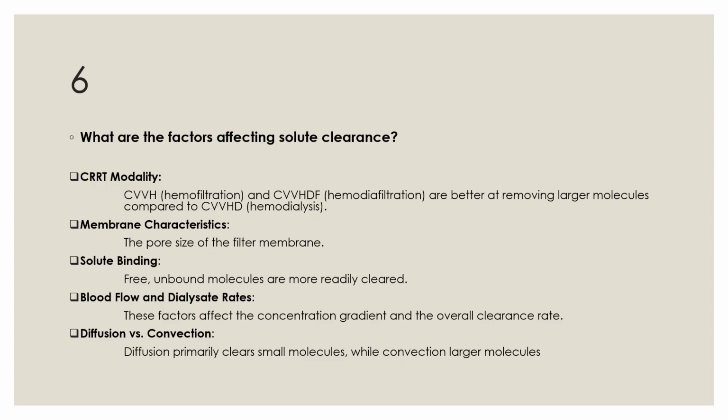The degree to which a molecule is bound to plasma proteins like albumin influences its removal. Free unbound molecules are more readily cleared. Blood flow and dialysate rates. These factors affect the concentration gradient and the overall clearance rate. Diffusion versus convection. Diffusion primarily clears small molecules while convection driven by pressure removes larger molecules.